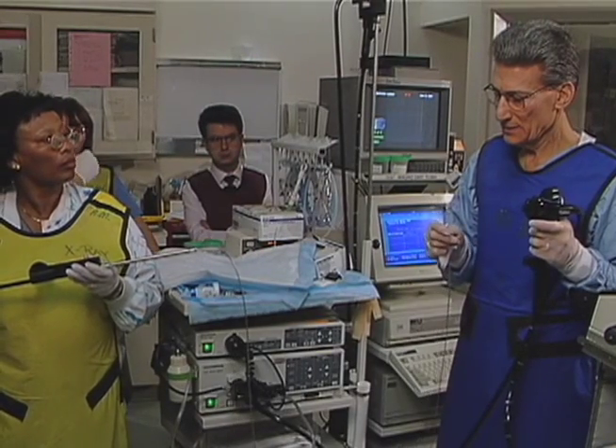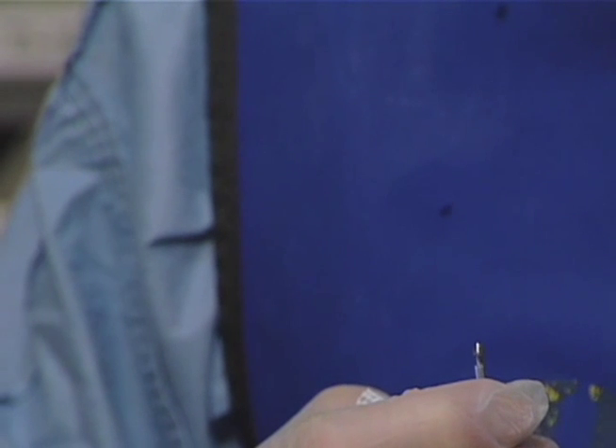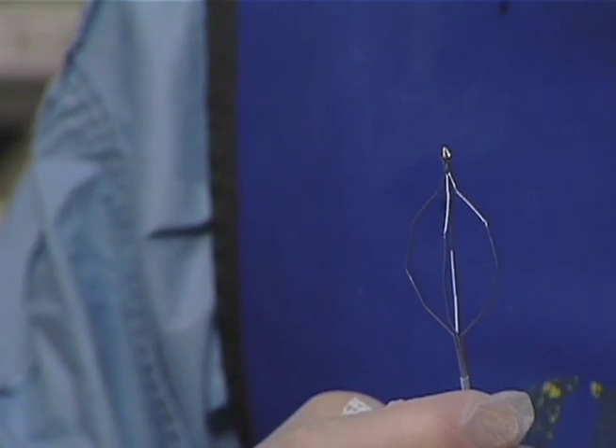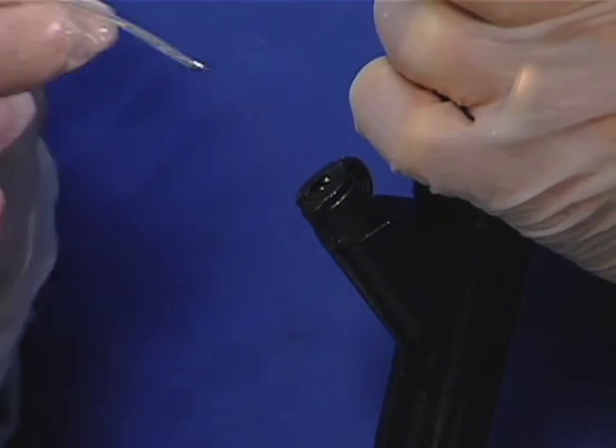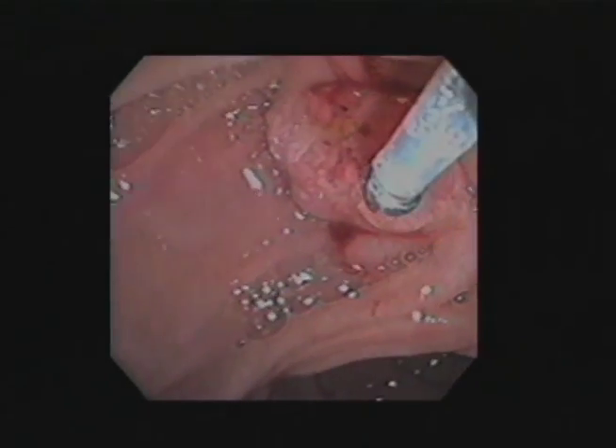In today's busy ERCP lab, the need for instruments that perform effectively as well as economically is an established criteria. Olympus has the answer to both these requirements and more with their mechanical lithotriptor.